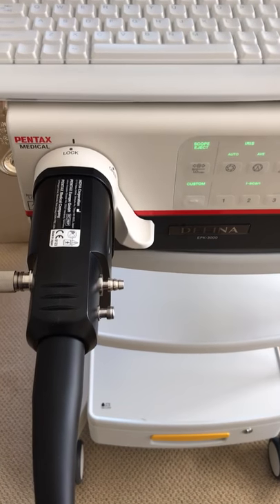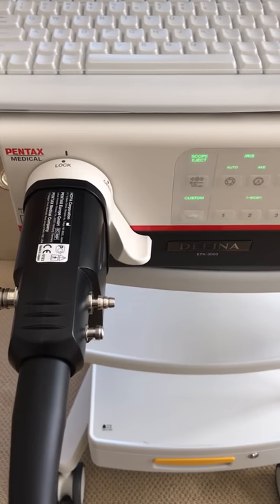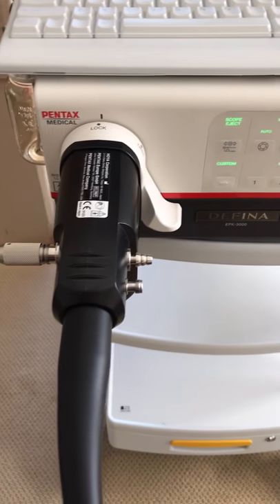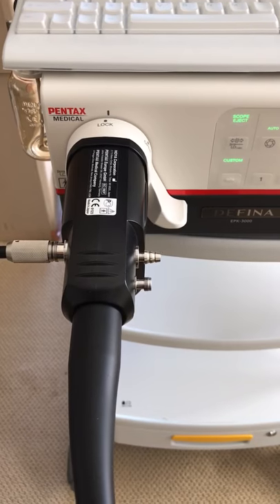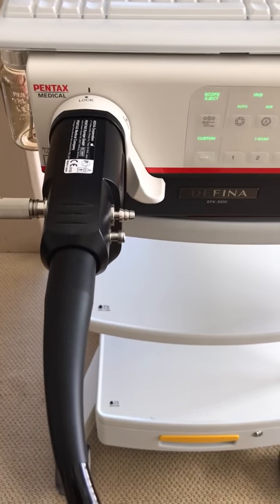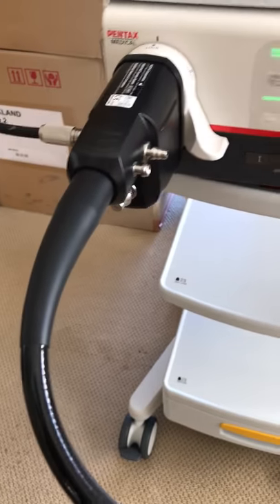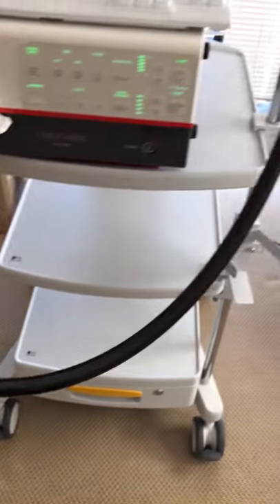Hi, Josh Nath here from JR Medical. I am the ENT distributor here in New Zealand for Pentax. What we have today is the transnasal esophageal scope from Pentax, specifically made for TNE — transnasal esophageal procedures. So let's have a look at the TNE scope.